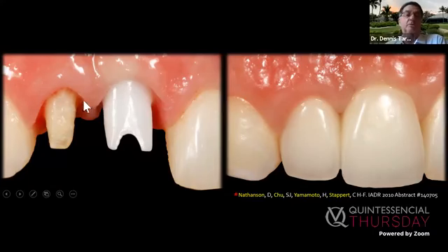So what you see here, we're holding this tooth in place and saving it because I don't want to lose this papilla. It's got supercrestal biologic width, and that's what I want. And here's the final case in place. There's maybe too much tissue here. But notice it's still leaving a little bit short, shrunk a little bit, but we have at least a scallop.